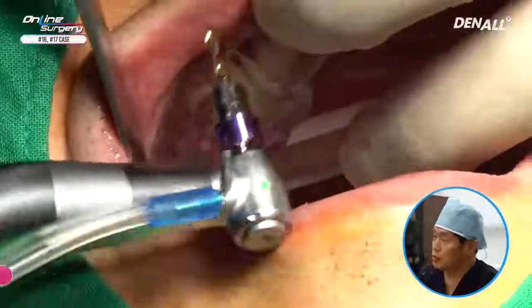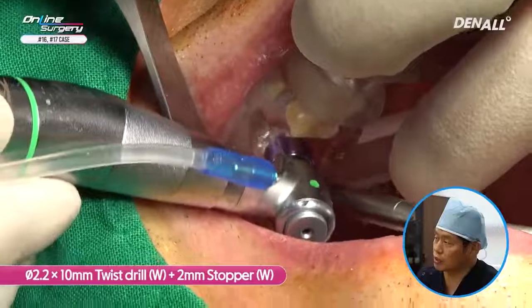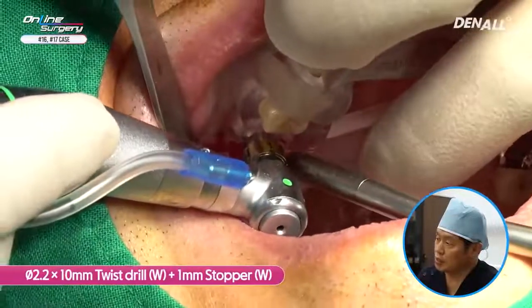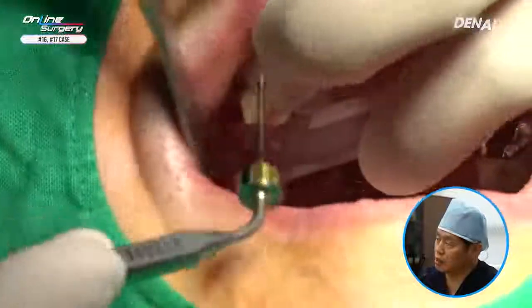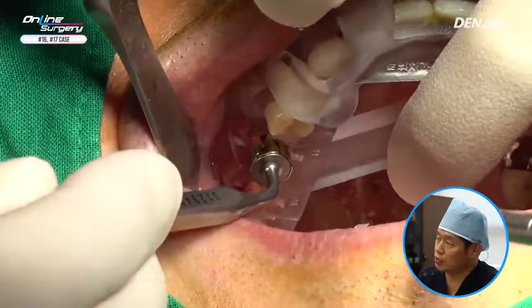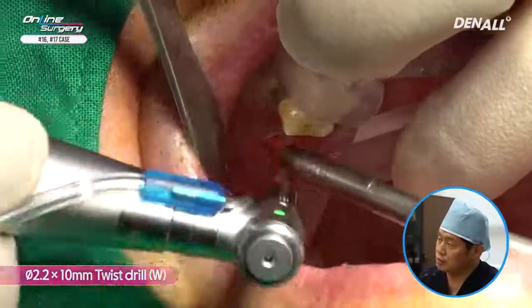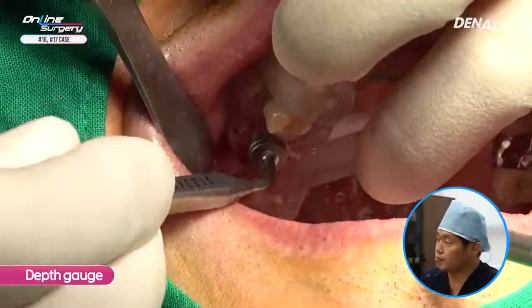Check with depth gauge, even though I'm pretty sure it's not penetrated. On OneCAS 10 mm, 2 mm stopper has been connected, 8 mm drilling is being done, and after that 1 mm stopper is connected and drilling is done up to 9 mm. After that, depth gauge, 1 mm stopper is connected to check whether there is penetration. I'm going to drill up to 10 mm, so I'm not going to use a stopper this time. Depth gauge is used to check for penetration once again.